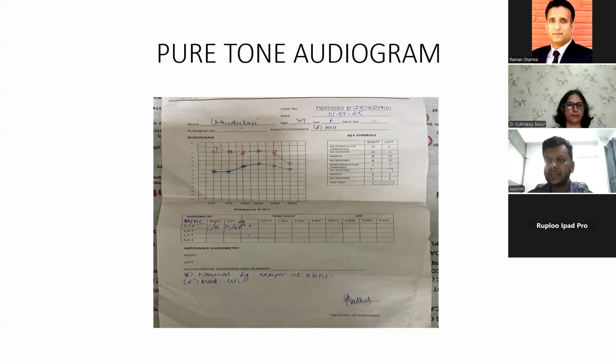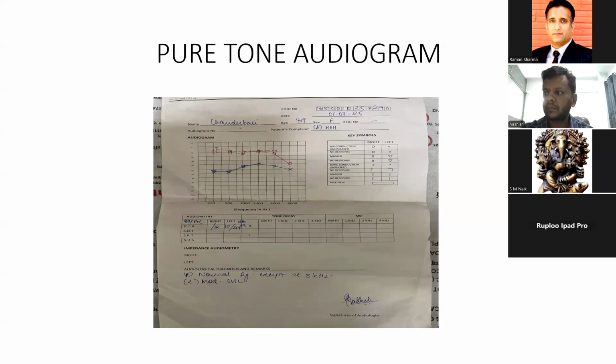Sir, then the postauricular William Wilde's incision is given 8 to 9 mm behind the retroauricular groove. One more argument for adrenaline: it prolongs the effect of lignocaine. But here GA is being done, so we need not consider the lignocaine effect. Anyway, we can give saline adrenaline. Adrenaline is a must. Yes, the anesthetist usually prefers that we give saline adrenaline rather than LA adrenaline.